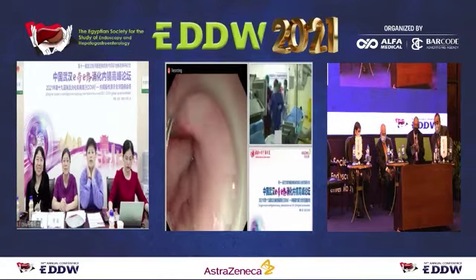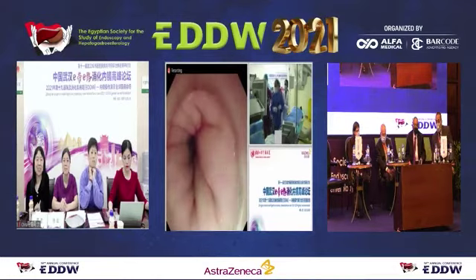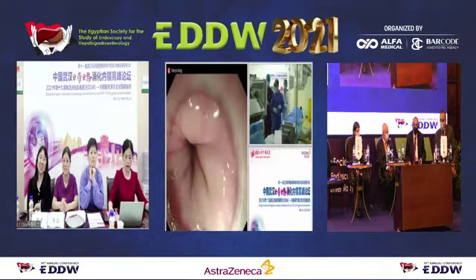Really, congratulations. It's a very fast procedure in your hands. Very well done and fast. Yes, thank you. Well done. Thank you. No, I'm just here to learn.